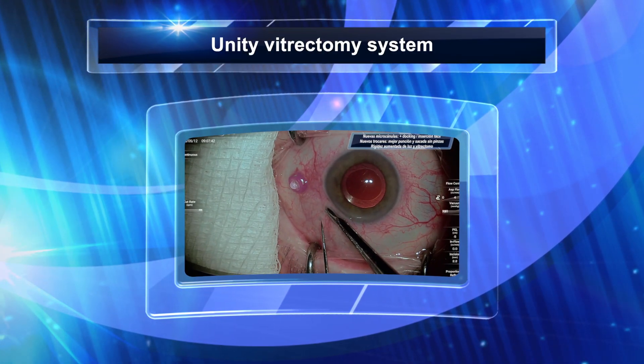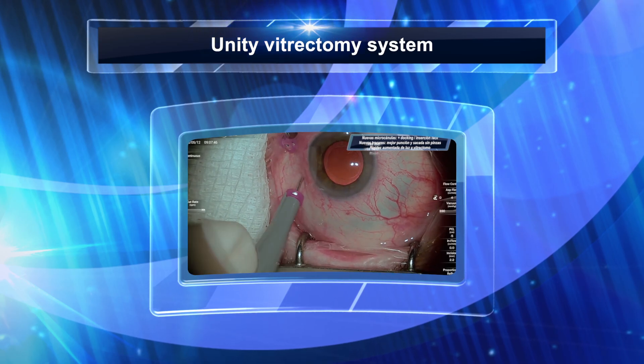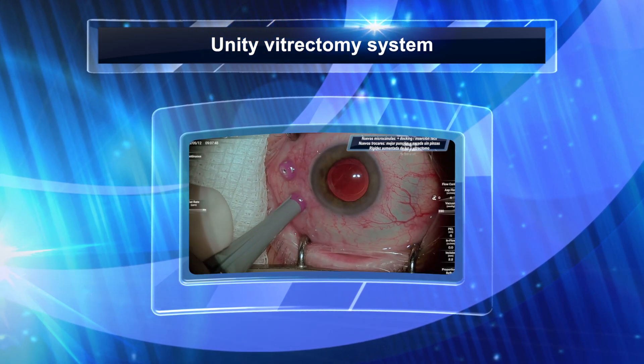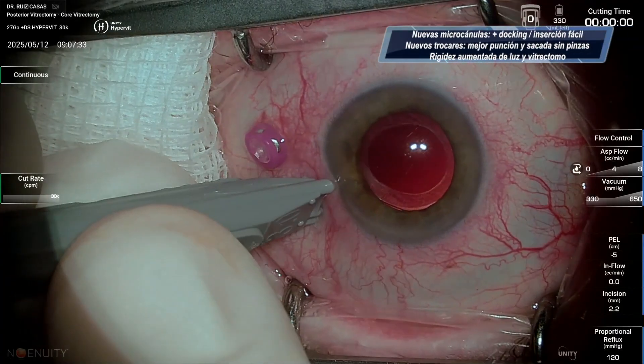These are two videos of my first surgeries with the Univirectomy system. This new device from Alcon is clearly a game changer.